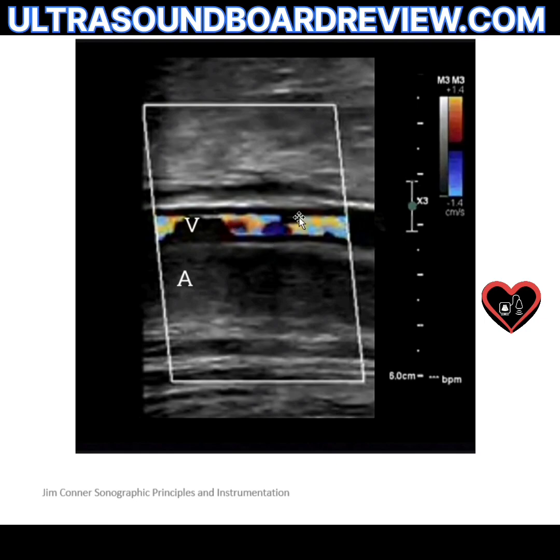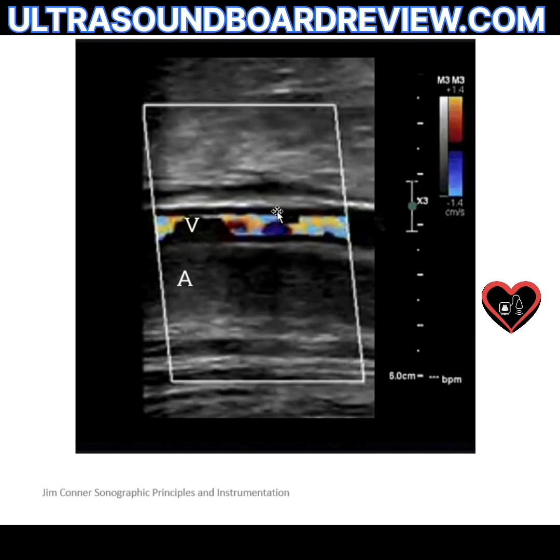Who cares about the vein? If you increase your PRF and scale, that doesn't fix the color Doppler in the artery. If you want to fix the aliasing you can do that by increasing your PRF and scale — but then reach for the color gain to fill in the artery.